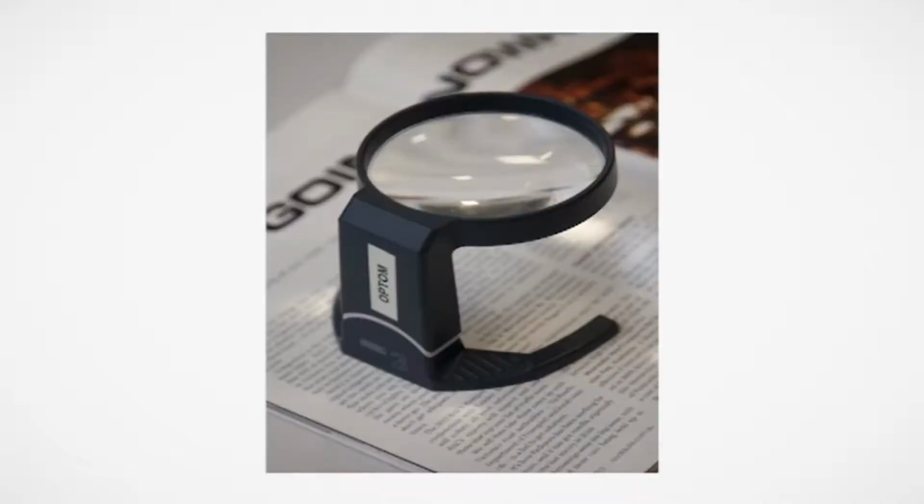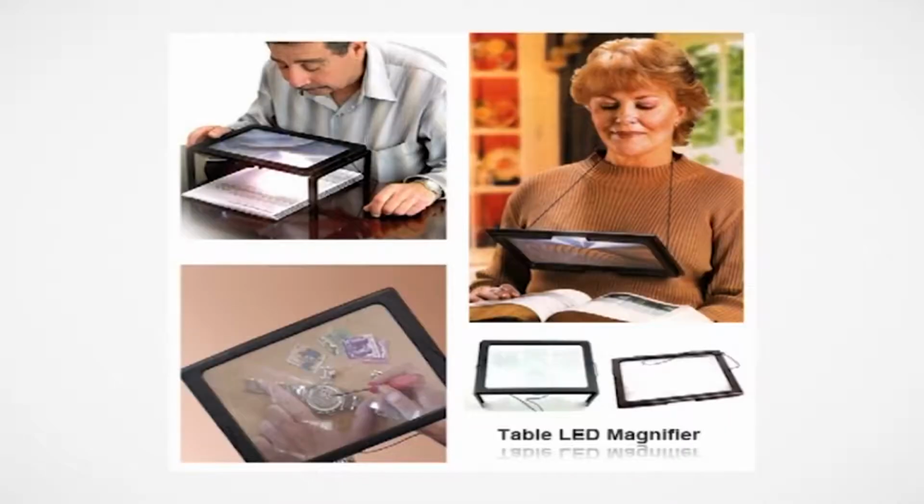They can cause excess shading and reduce the amount of light on the viewing surface unless self-illuminated. Most available designs make writing difficult if not impossible. Prolonged use of these devices may result in poor posture unless a reading stand is used.